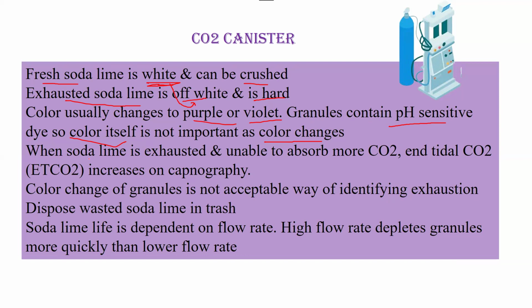Next, when soda lime is exhausted and unable to absorb more carbon dioxide, the end tidal carbon dioxide increases on capnography, because when you are using these anesthetic machines, you are also using capnography and pulse oximetry, all of those settings you have attached to your patient and are recording different parameters. Pulse oximetry will tell you the oxygen saturation, and capnography will tell you the end tidal carbon dioxide level.